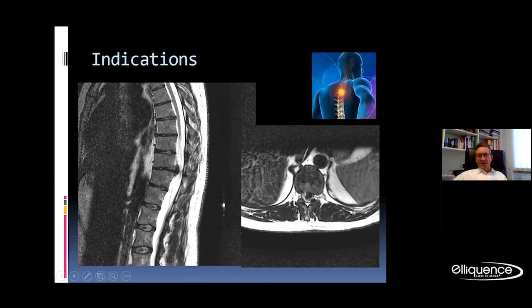And then the big question: the indications for these surgeries. At the end, it's always a clinical sign and how much it bothers the patient. If you consider any surgical approach on the thoracic spine, you have to figure out the compromise between risks and benefit. One of the big benefits on the thoracic spine is that even when you remove a little bit more than only the sequestrated disc, there's no high risk of instability.